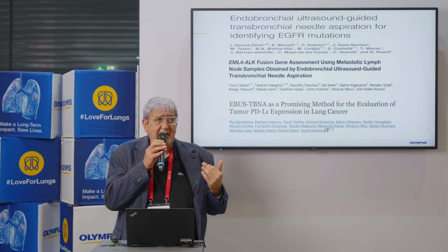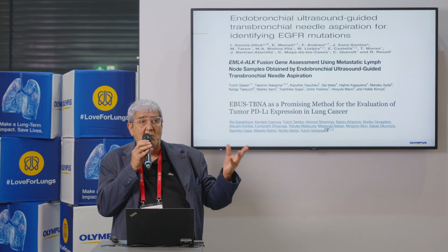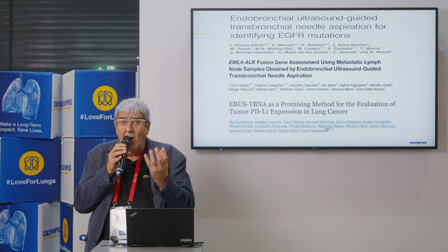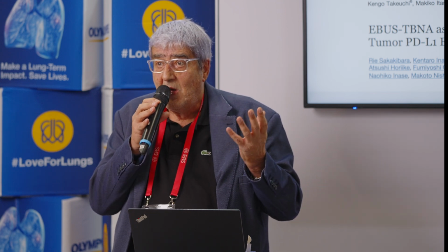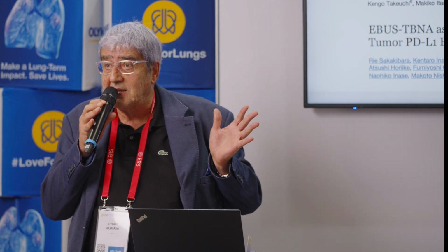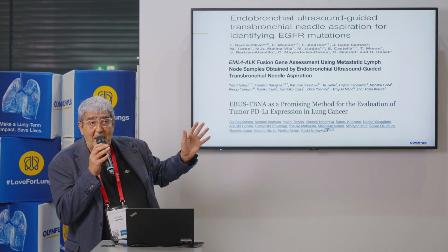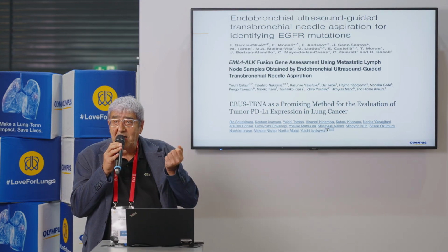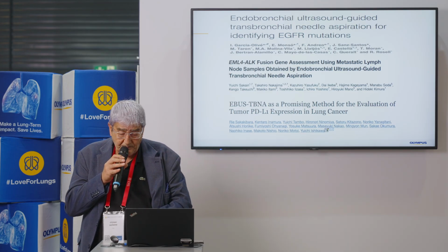Well, somebody can ask, oh yeah, but you can diagnose pulmonary lesions, but what about the quality of the sample? What about the adequacy of the sample for genotyping or for molecular evaluation? There are a lot of papers in the literature that report that EBUS-TBNA samples are able to provide material adequate for genotyping the tumor.